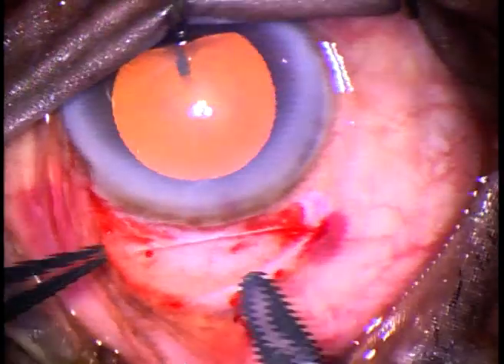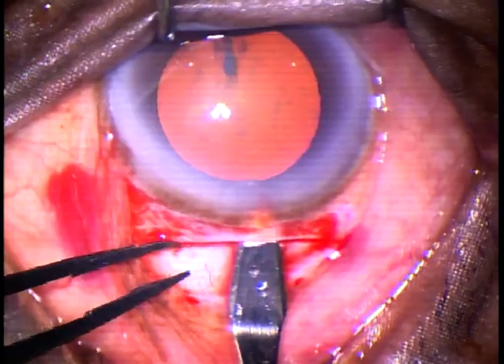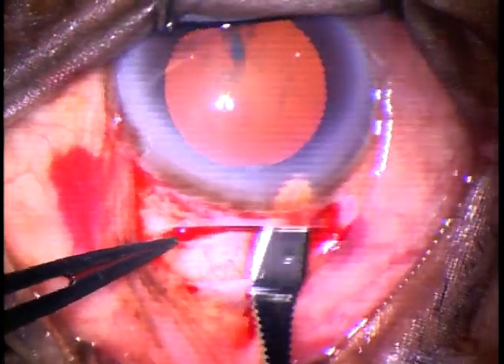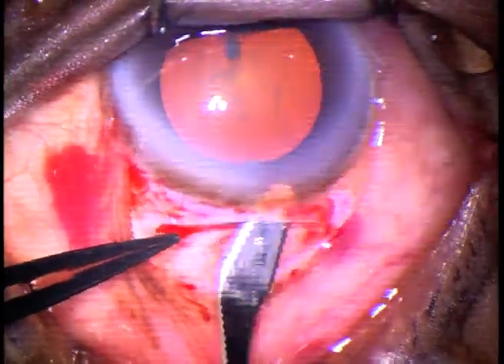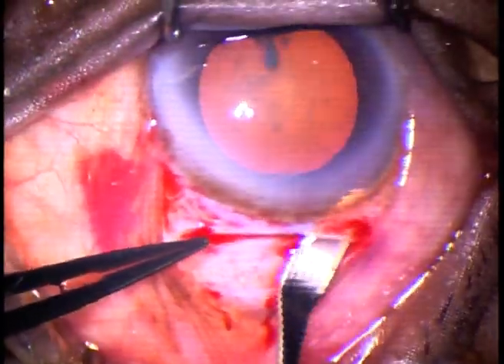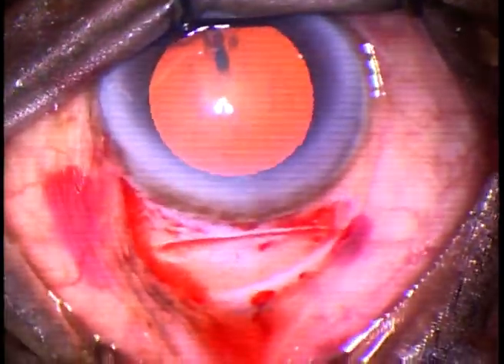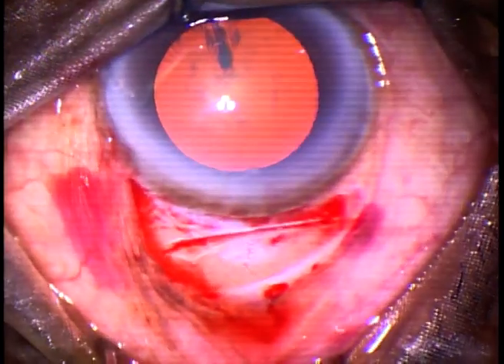This is how we make the tunnel. Go into clear cornea. Sweep backward and left, and then sweep backward and to the right, for making the tunnel from one side to the other side. I usually start at the center, make the tunnel on the left side from center, and then from center to the right side. Thus, I complete the tunnel.